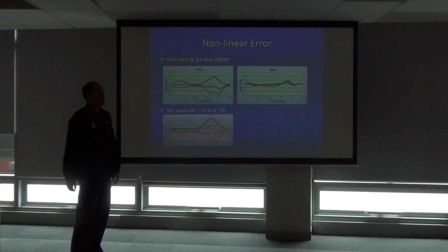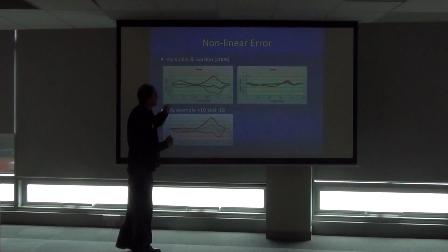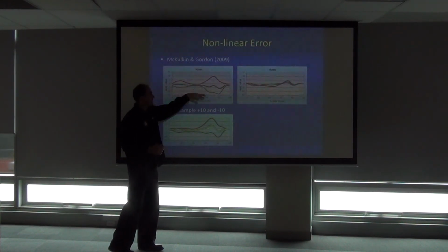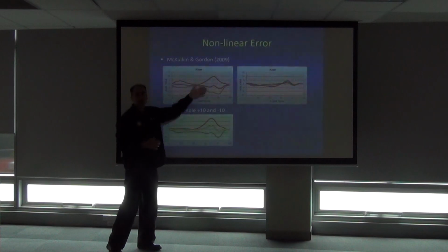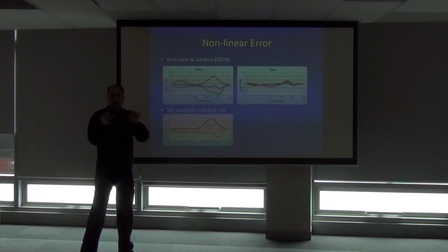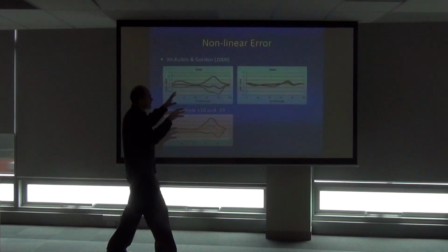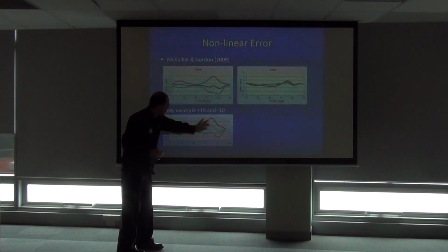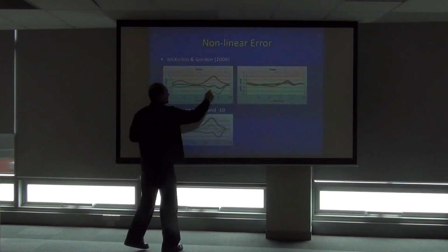Yes. We look at this, okay, that's externally rotated, almost the same as here, around 10 degrees, that's the other way, 10 degrees, and that's slightly externally rotated, maybe only 5 or a few less. Okay, we'll start with that, plug that in, and then it was just a matter of manipulation. We're trying to get these as close as we could to being identical, so they should converge somewhere in the middle.